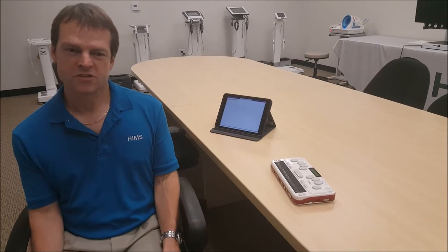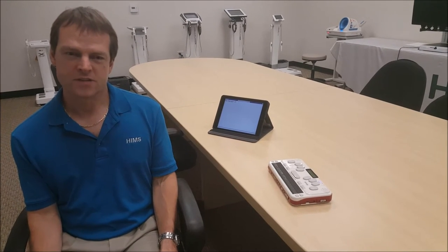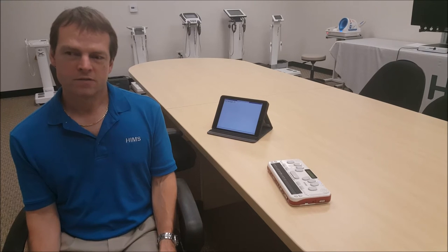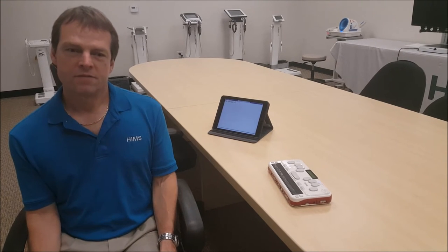For example, the shortcut key to load the optional HIMS dictionary is enter, backspace, D. If I was writing this using one-handed mode, I would press the enter key, the backspace key, dots 1, 4, and 5, and then press the space bar to conclude the keyboard entry.